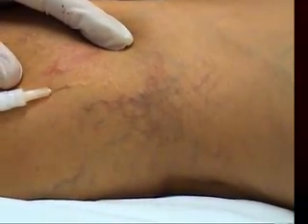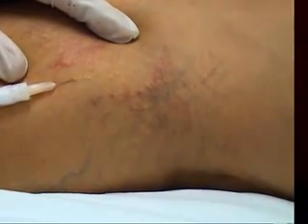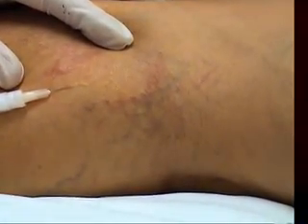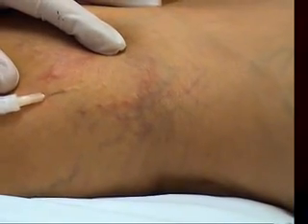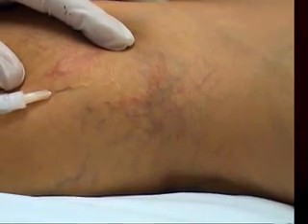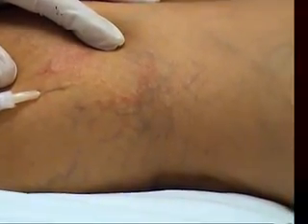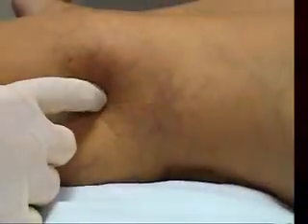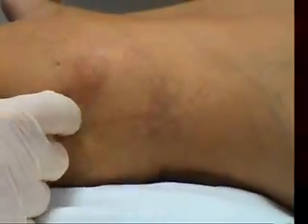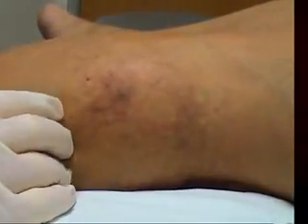Don't inject too hard. We've got foam just north of the site that I'm injecting. So all these veins look nice and white now. They're all foamed. And a bit of extravasation again. Now obviously you don't want to extravasate, but just a little bit won't do any harm. Plus, don't forget that 3/4 of this is air, so it's even better.